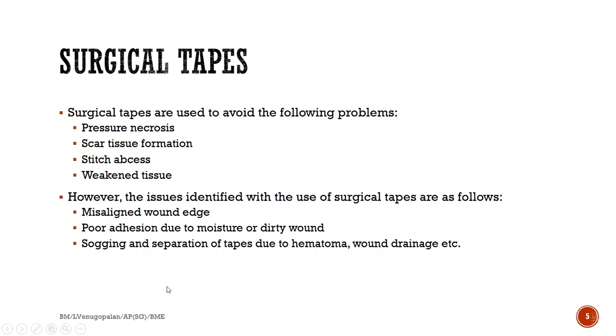So surgical tapes are usually used... I mean, when you suture a wound, you have to puncture the area around the wound in order for the thread to go through the skin, right? Also, while suturing, you're pulling the skin together and tying it with a thread. So this often induces pressure on the surrounding tissue. Already the surrounding tissue is inflamed because of the incision that has been made or the injury that has occurred. So you are escalating the chances of inflammation by puncturing the wound ends and trying to sew it together, right?